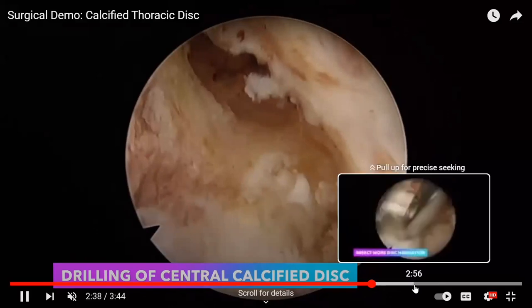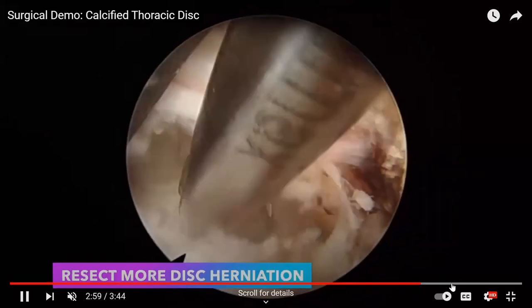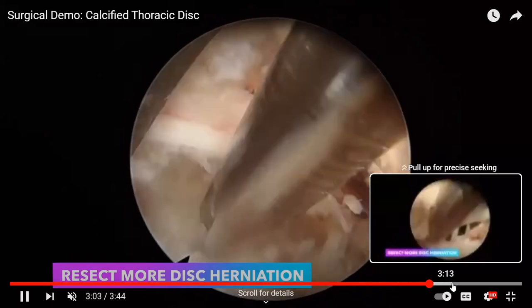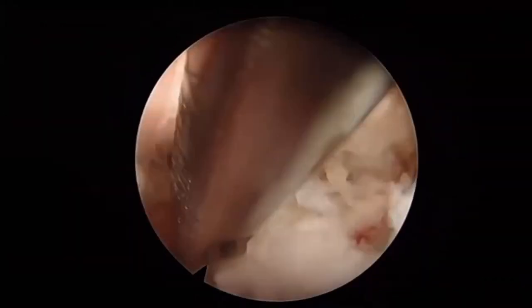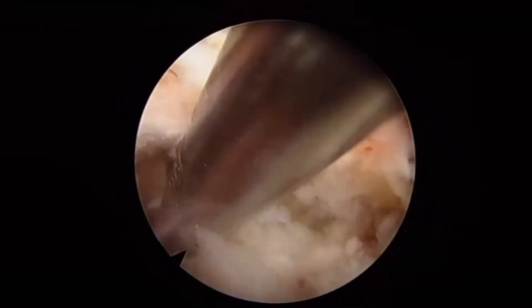So you could do all this through, again, a 6-7 millimeter incision, super minimally invasive, especially compared to the typical procedures, which would be either a thoracotomy or some type of transpedicular or costotransversectomy. So now you see the dura really well here, and he's getting just the last couple pieces of disc before calling it a day.